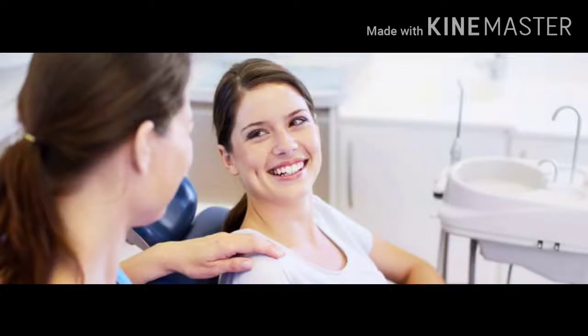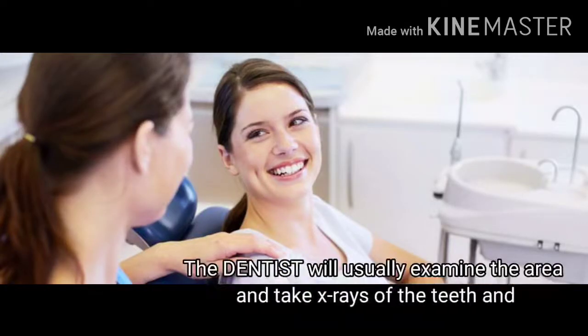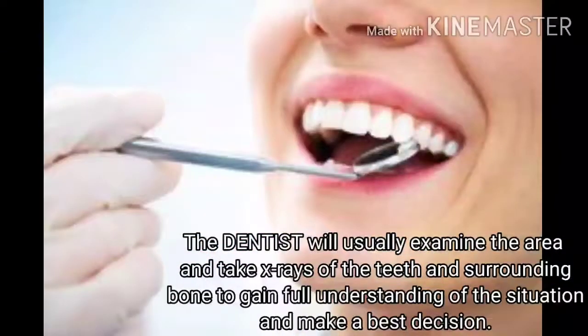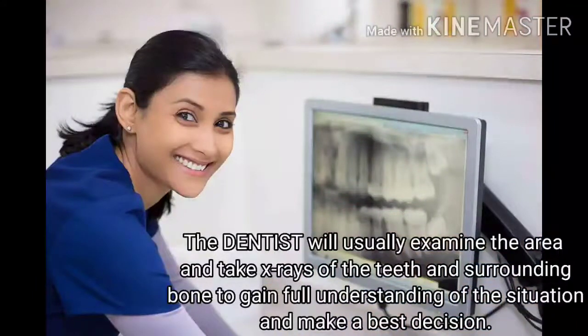The first step in the procedure is assessment of the case. The dentist will usually examine the area and take x-rays of the teeth and surrounding bone to gain a full understanding of the situation and make the best decision.